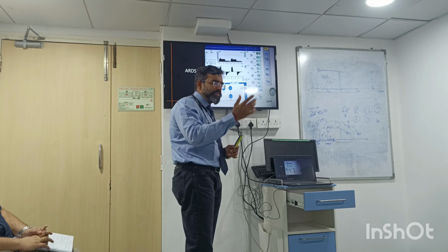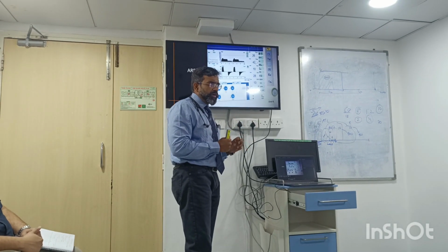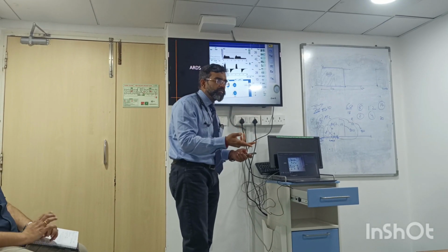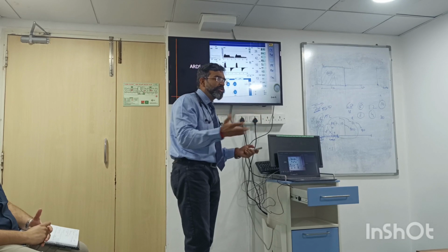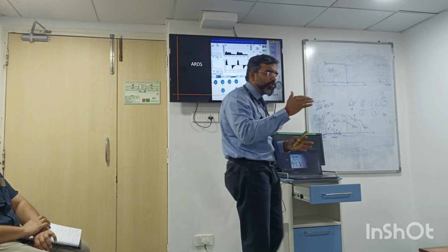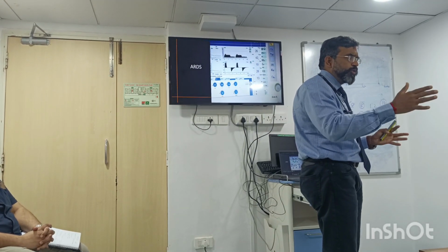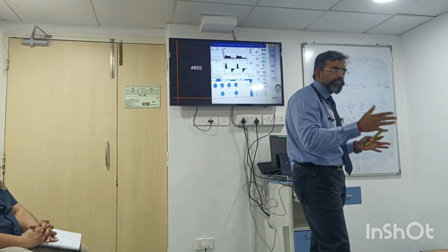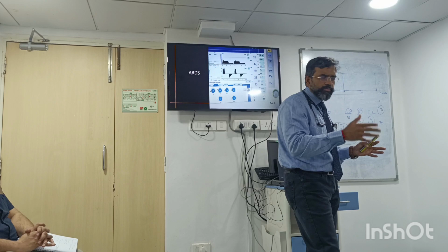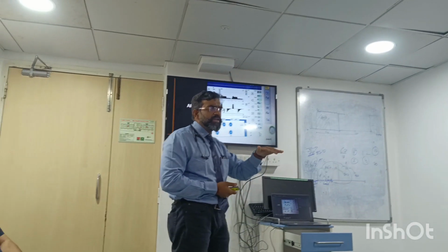So that gives you a kind of an estimate. Oh, this is my mean pressure going up. Whatever I'm doing, I might just change my I ratio, but nothing is happening because I changed my RR. My mean pressure is the same only. It's not going to improve my oxygenation. So I want to look at that. Obviously, I don't want to go to a mean pressure of 30 or 35 because that is harmful. I know the harm is lesser when it is much lower than 30.